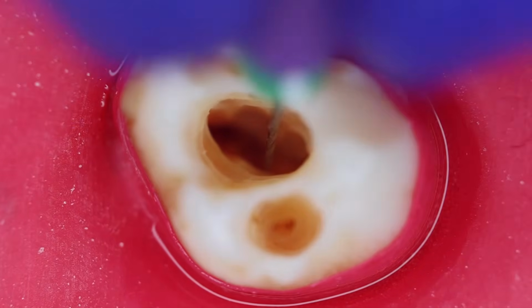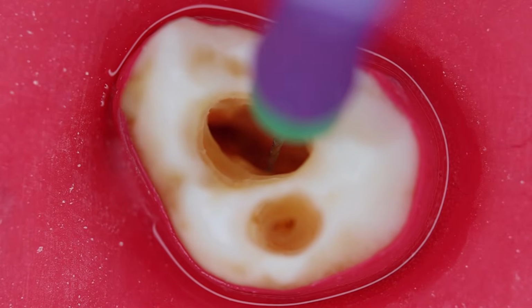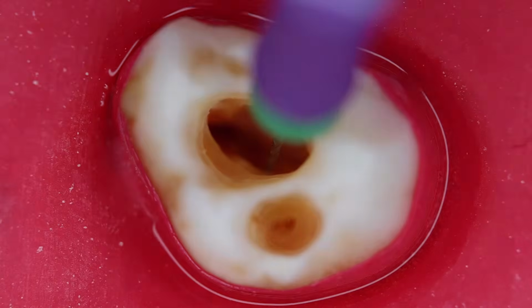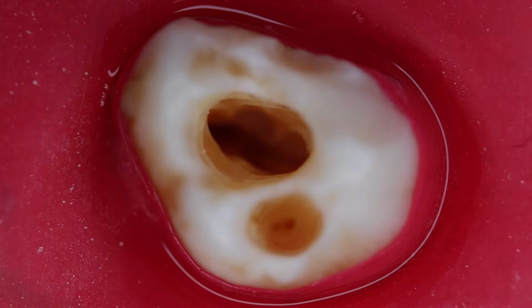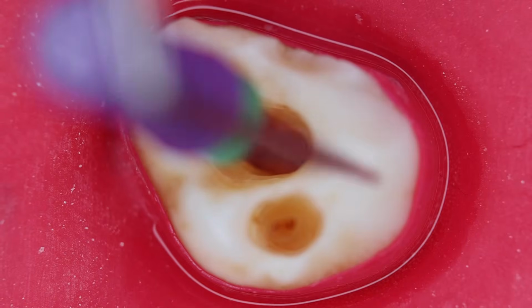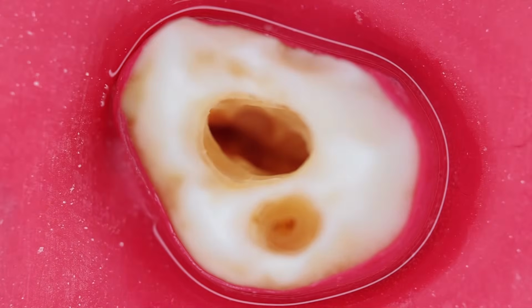Over here, see the angulation of the file. With this angulation of the file, you can justify that it is going into the distobuccal cusp. So this is the distobuccal canal, and then below it look for the palatal canal, which is a larger canal. So this is the palatal canal. The angulation of the file again goes towards the larger palatal cusp.